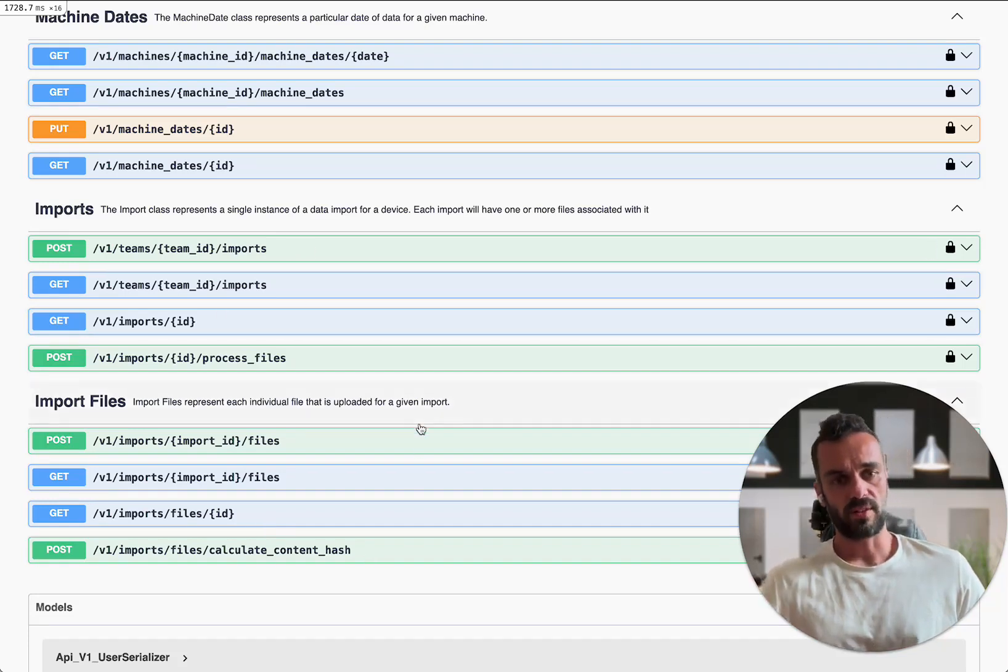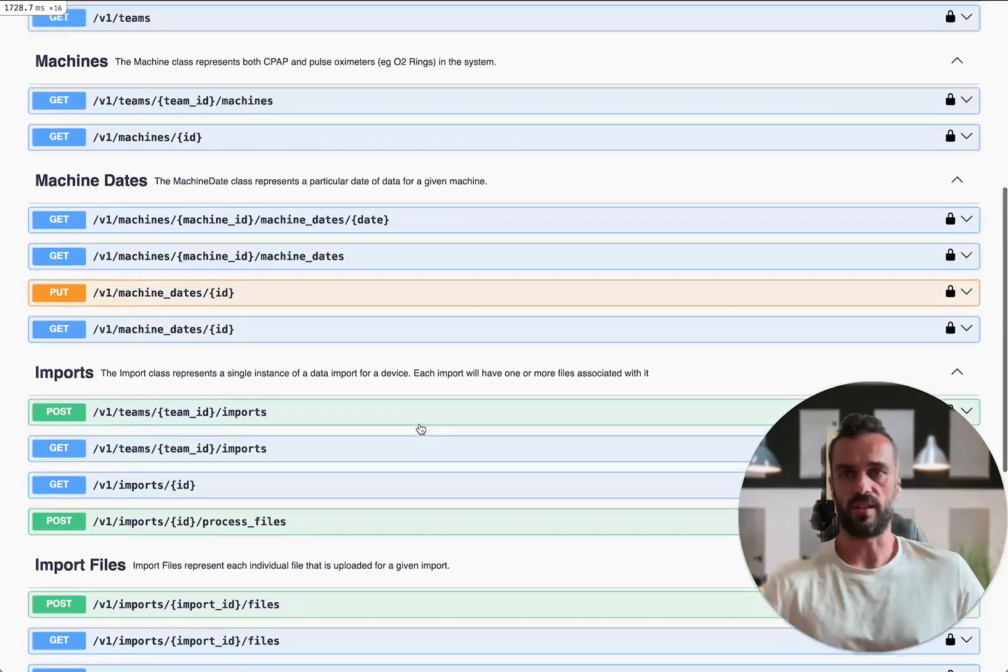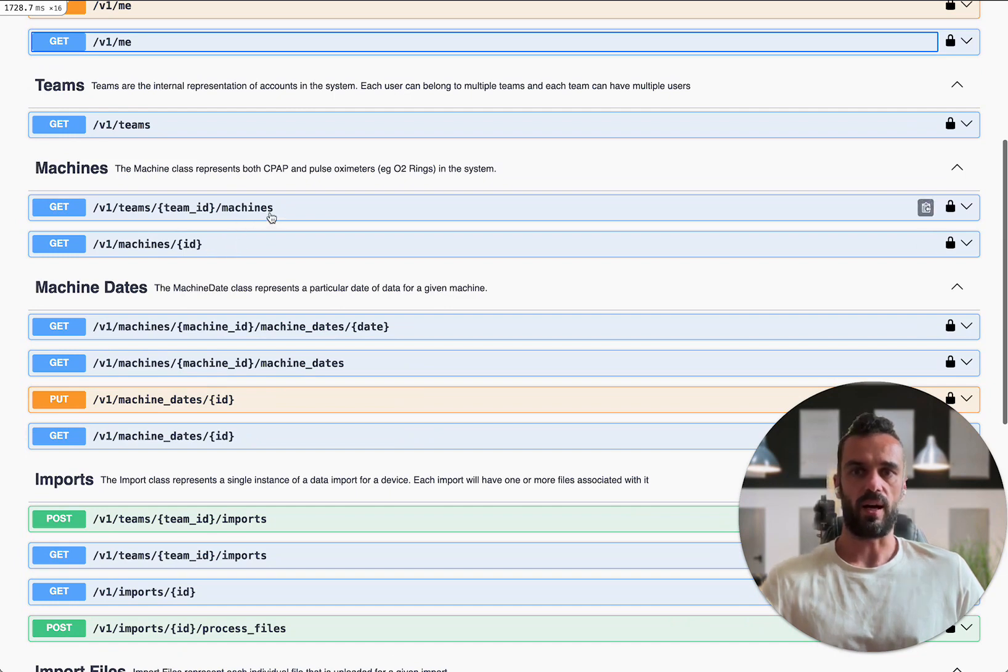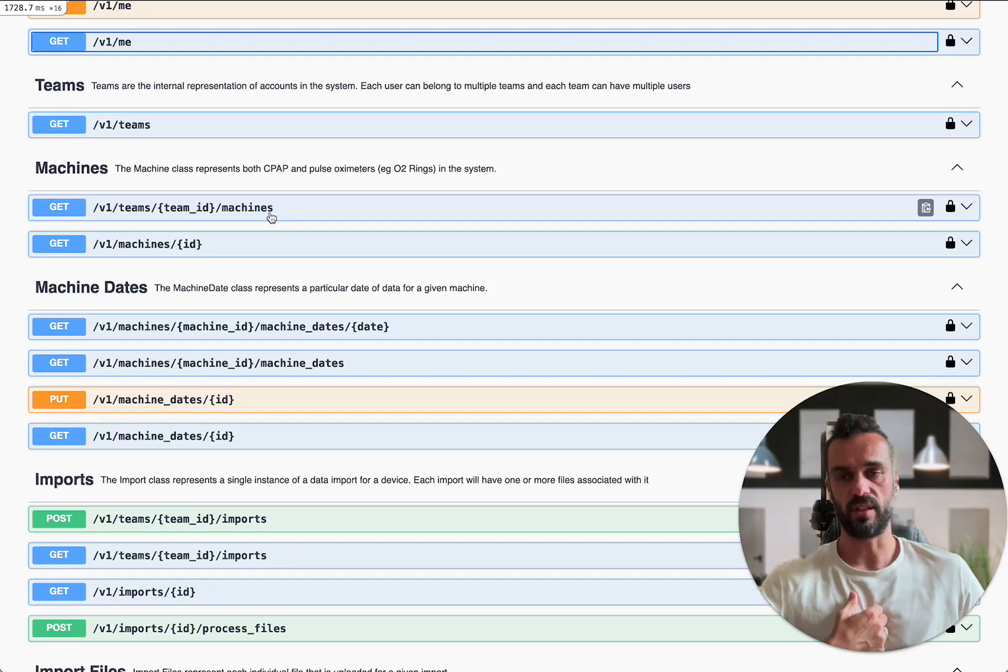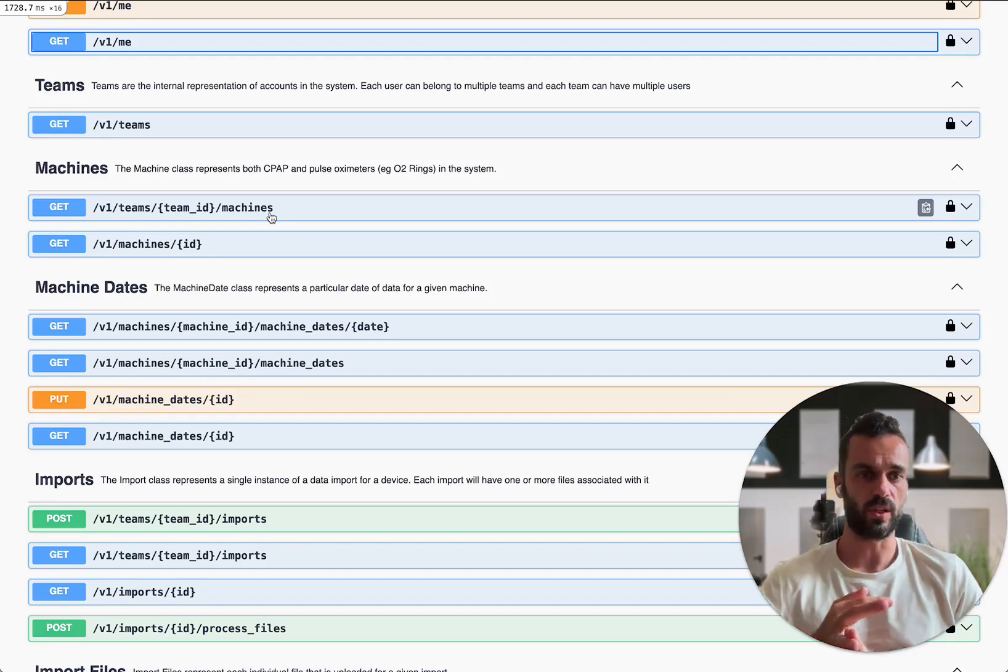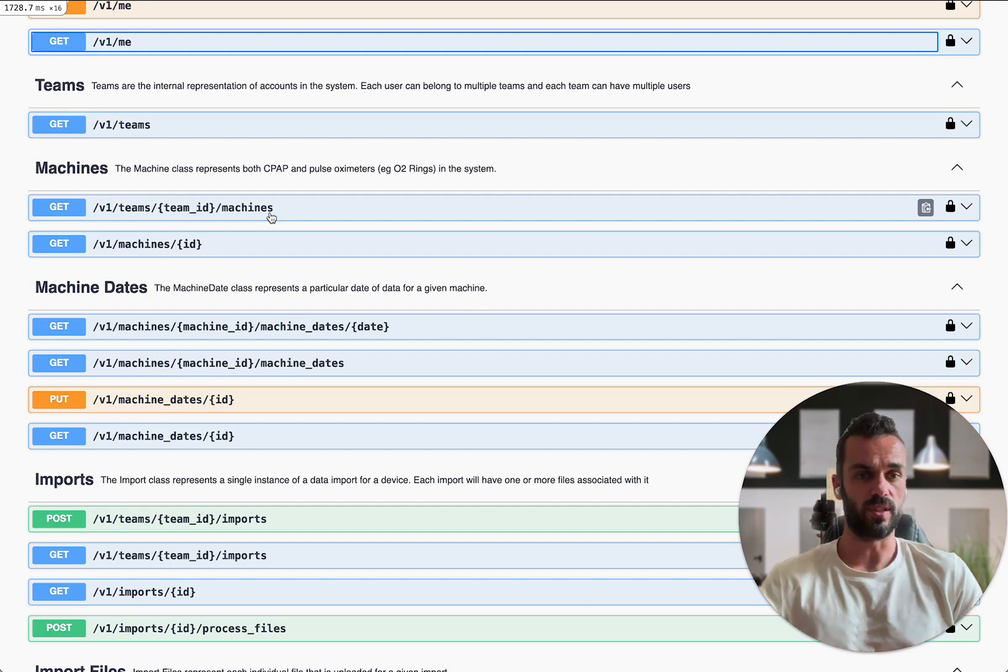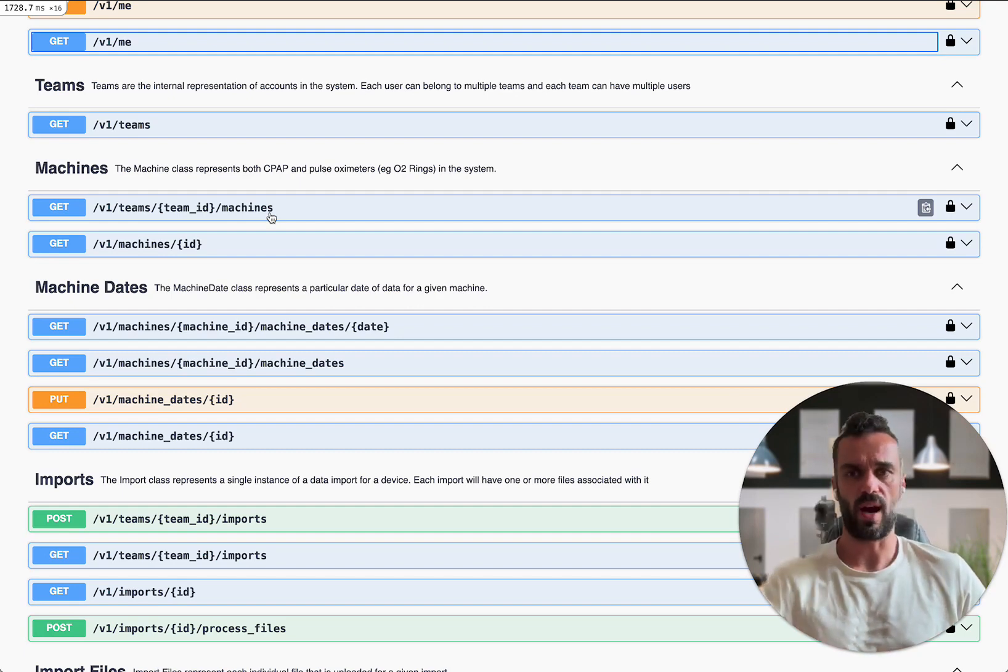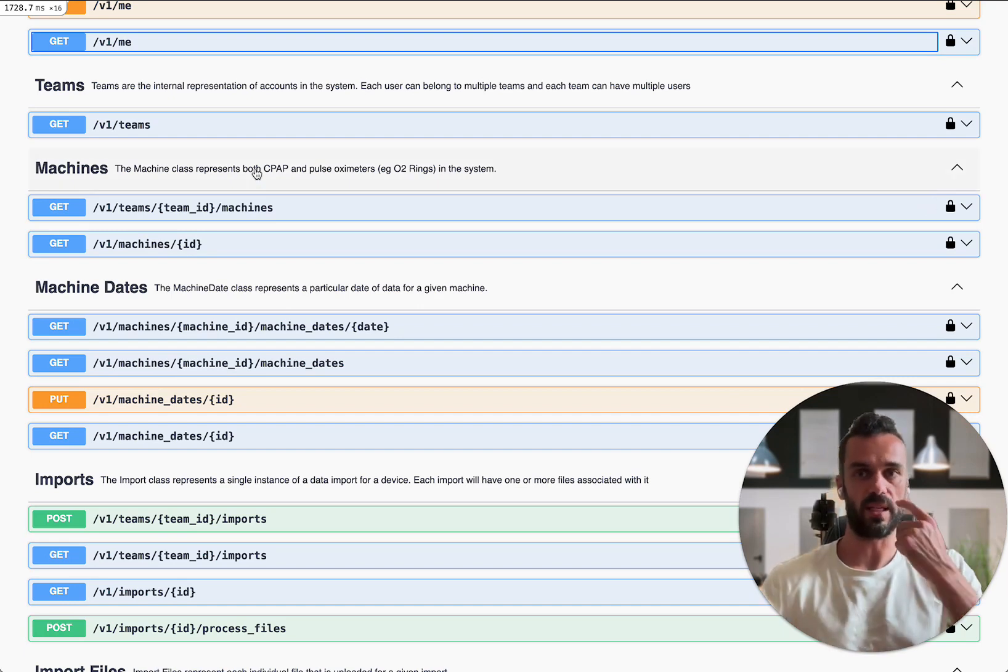Once you have data in there you can then also interact with the data itself. If I go to for example this machines endpoint, I can query for all the machines that I have in the system. That's my CPAP machine, any O2 rings you might have, anything like that. And then I can view the data directly from those devices. So let me just quickly show you how that works. First up I need to know my team ID.